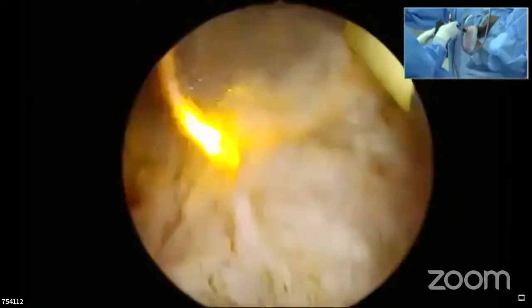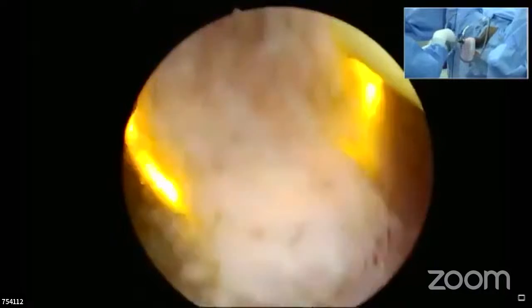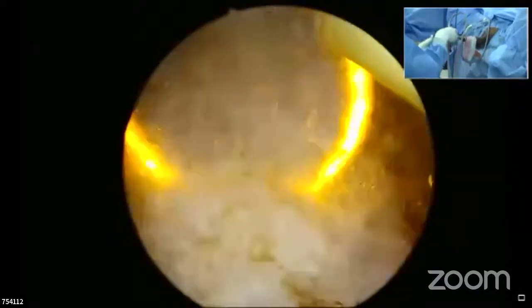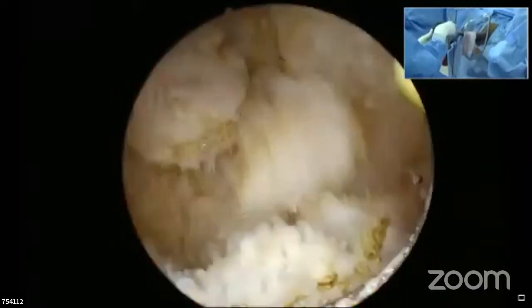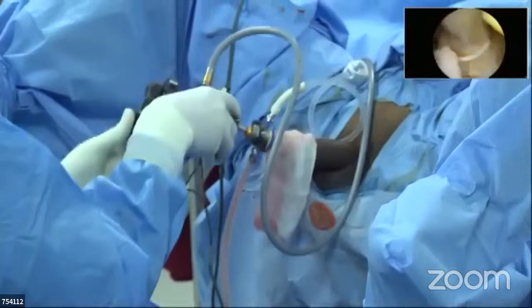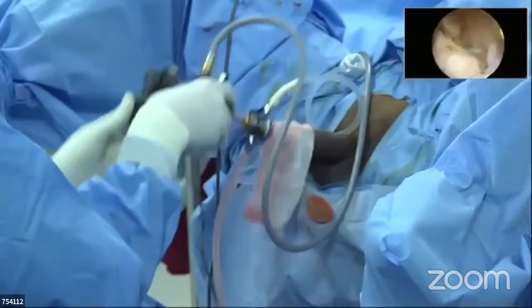In the external view, Malik? Yes, sir. Next to his resectoscope, I saw something else hanging. What is it? There's a gauze piece. That's the gauze piece. Okay. Why does he want to keep the gauze? No, sir. I think leakage was existing there. I think it got opened up. And that's all. Okay.